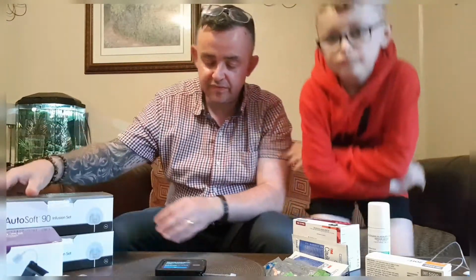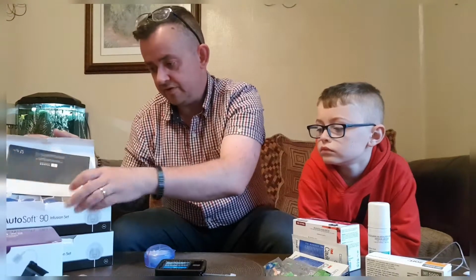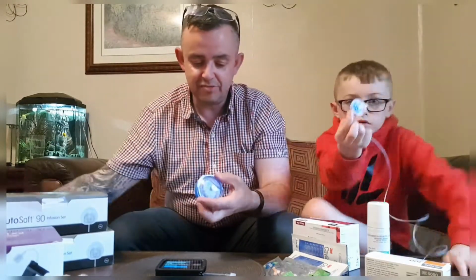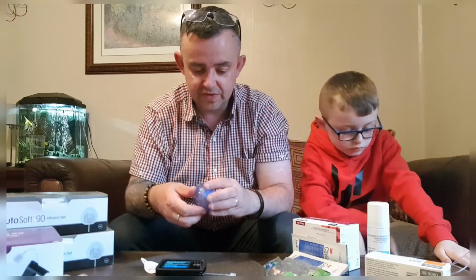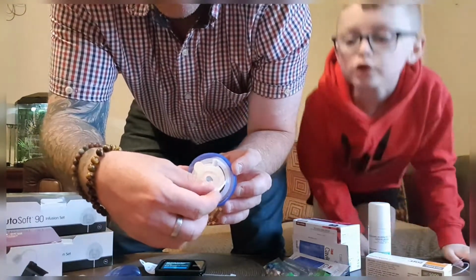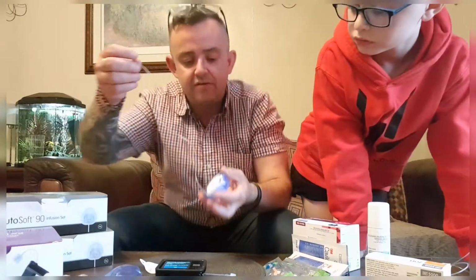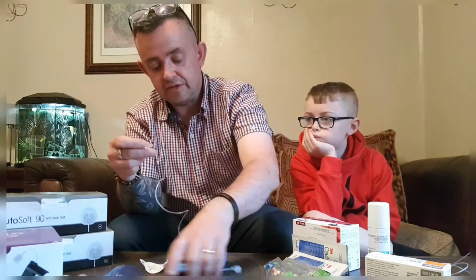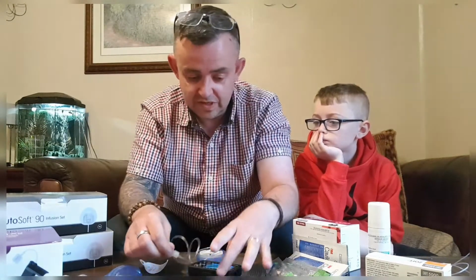So what we need now is the cartridge and the infusion set. So we take the plastic off, take the bottom off, take the top off. And you'll see there's a little lug in there, and you have to just pull that down, and then you're able to pull out all of the tubing. When you've got all the tubing out, the pump is asking you to connect. So that connects in there. You have to screw it in tightly, and then you press OK.